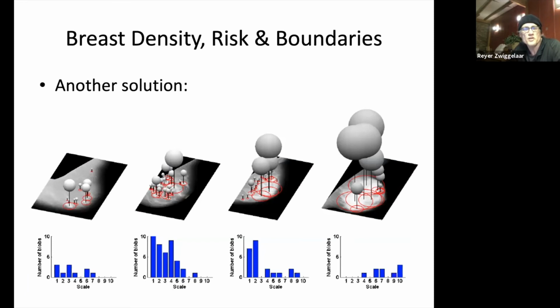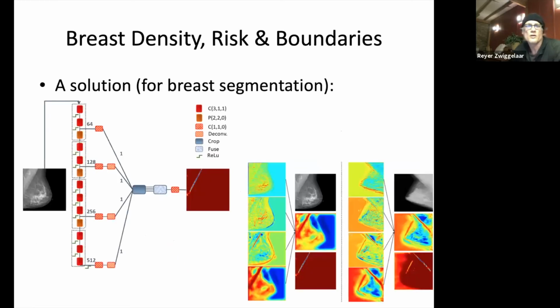In all of this, this work started with segmentation of the pectoral muscle and the breast itself, but more recently we've come back to that and used very recent techniques to do segmentation of the pectoral muscle in this case. And that has improved our overall segmentation. So if you've got a better starting point for these things, then in general, your results improve as well. So that's one of the reasons why we went back to looking at these more traditional segmentation aspects that are sometimes very difficult to find.